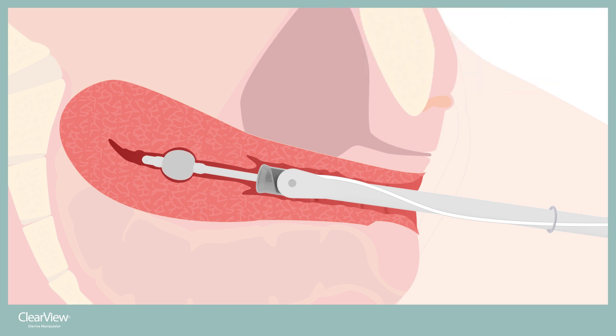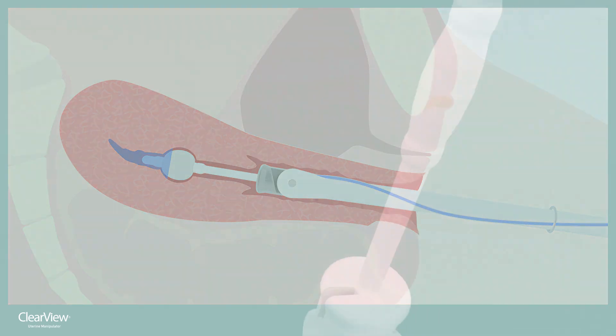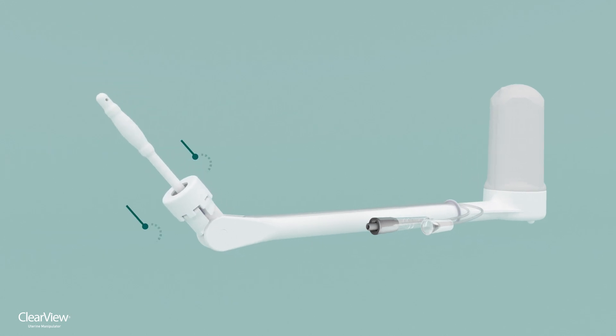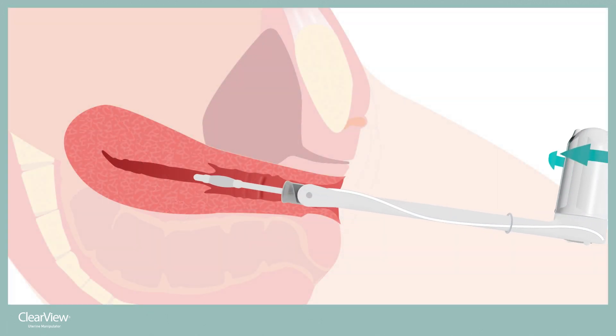The tip balloon is inflated using the balloon inflation valve. The tip balloon is reinforced with cuffs on top and bottom. The dye injection port allows for effective chromotubation when necessary. The one centimeter spacer is included to ensure the length of the tip properly matches the size of the uterus, reducing perforations. If the spacer is needed, it snaps into place in seconds, effectively giving the device two separate tip lengths.